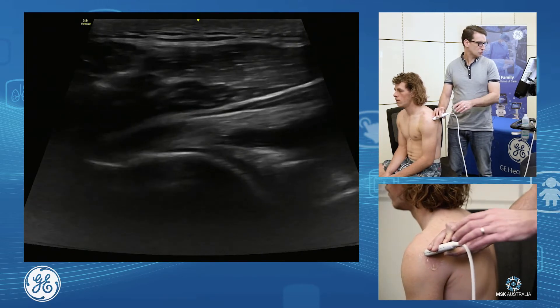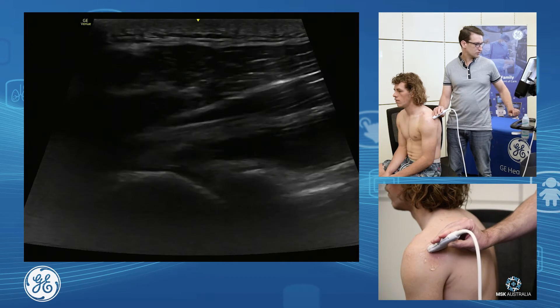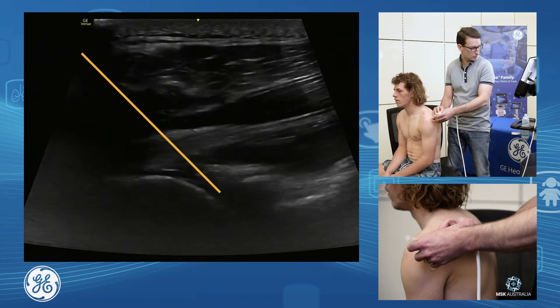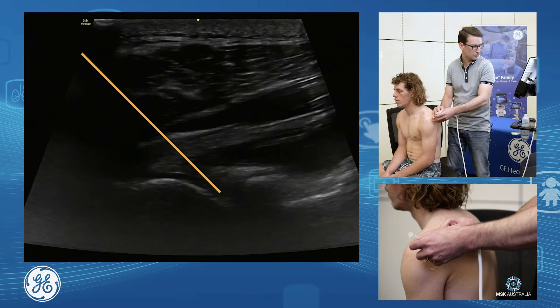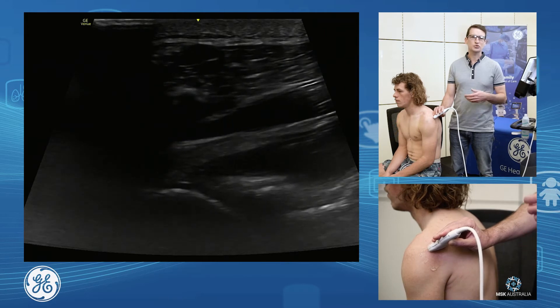The way we inject is we move and have our joint in the middle. We come in from a lateral approach after we've sterilized the skin and just drop down next to it, dropping down into the joint capsule from this side. We can also inject into the joint via an approach to our bicipital sheath at the front.